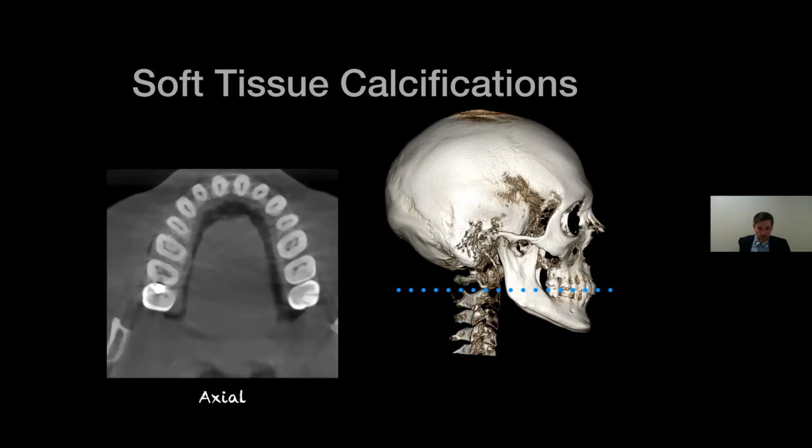So I would recommend at least a full day course, a 1-day course, and there are many out there. The one that we've developed for Planmeca is 1 full day of radiology, and the second day is all implant workflows with CAD/CAM and how to manipulate the implant software. So I would say at least a day long course. But any way you can get more exposure to it, like through webinars like this, would be an excellent starting point.